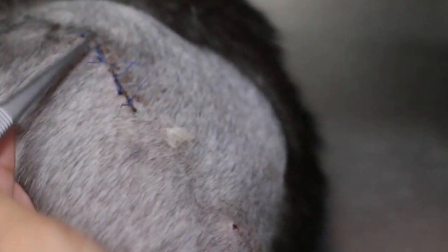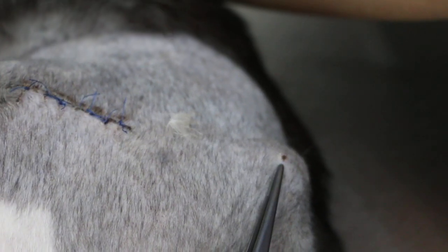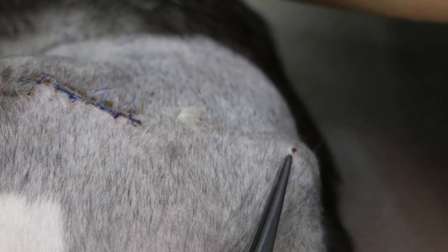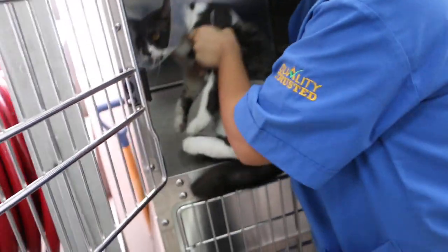And then it comes up to the end there. That is the pin area, which will be the area where you remove the pin 8 weeks later. Today is 8 days after surgery — so it's only one week. Now we bring the cat out. You can see that he's going home today.